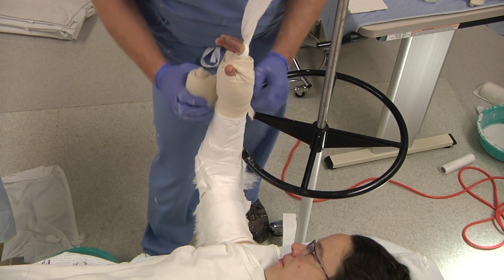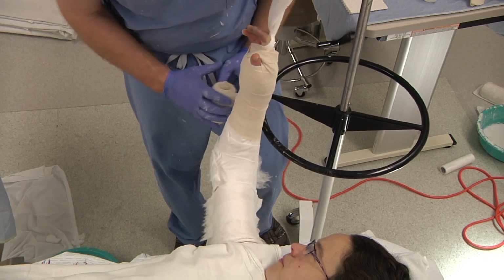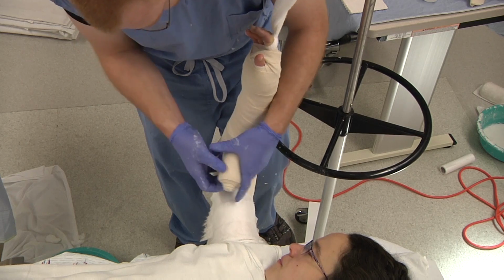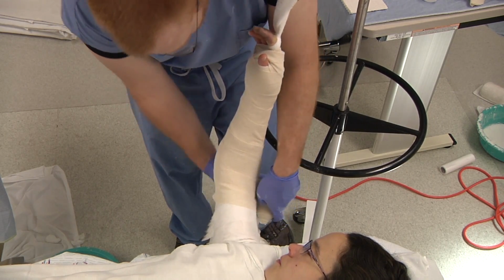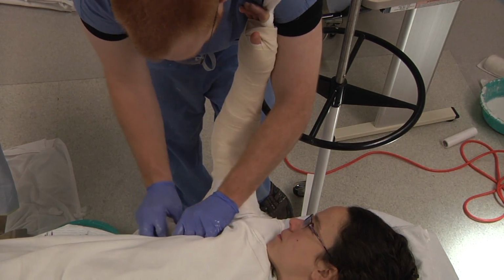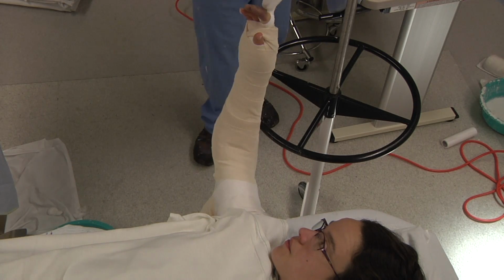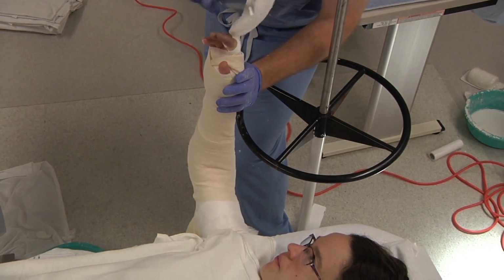You can double spin, go around, and you can move your bias down the arm. When you do come to this area, it's very simple to stop. Generally take the bias, tuck it underneath the patient's arm a little bit to hold it there. And from here, you can, with your traction still in place, or you can cut your traction.